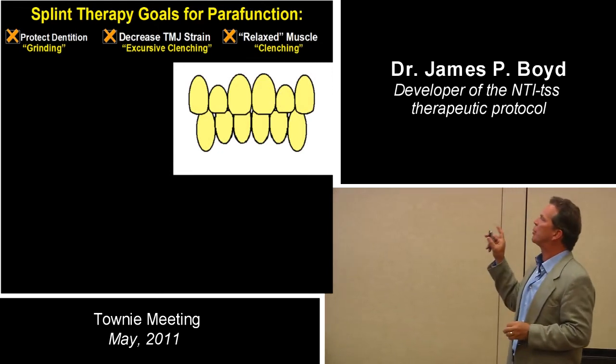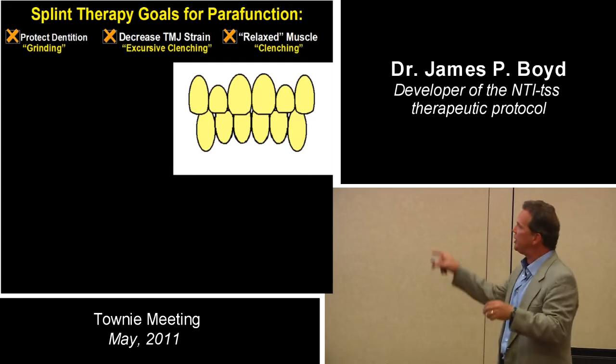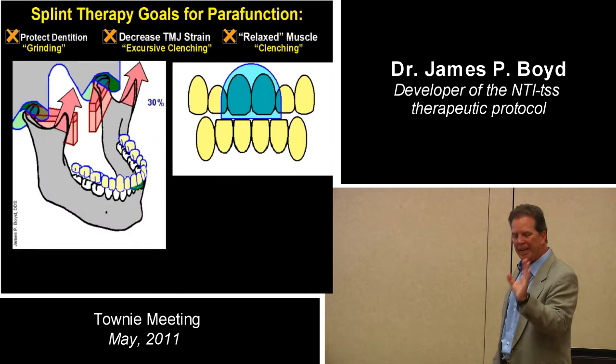Here's an anterior deprogrammer that's used in the chair. Put it in, Pankey jig looks real simple to that. Tap, tap, tap in the chair.